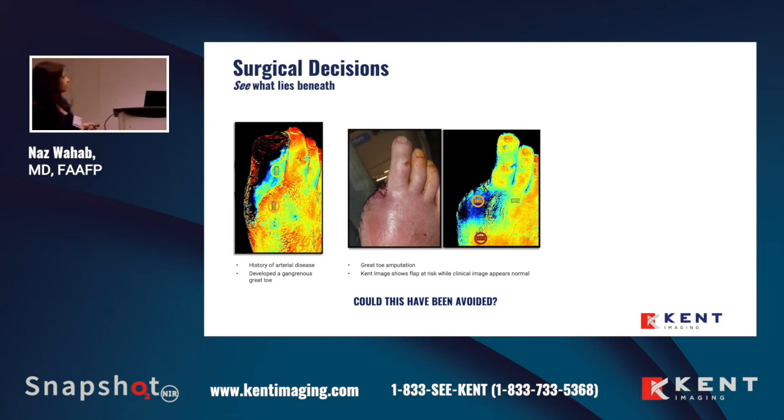So you can see here, we had a patient prior to amputation imaging. And you can see that it's a little bit difficult, but there it shows about 40% oxygenation there and about 64 here. So nonetheless, the amputation was performed. To the naked eye, those of us who have been practicing a long time, I think we take for granted that we have a certain clinical acumen that we know and we can predict. But I think most of us could probably agree that this didn't look terrible, and you probably couldn't demarcate exactly where the issue is really happening.